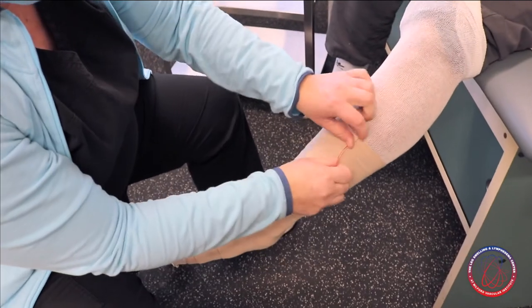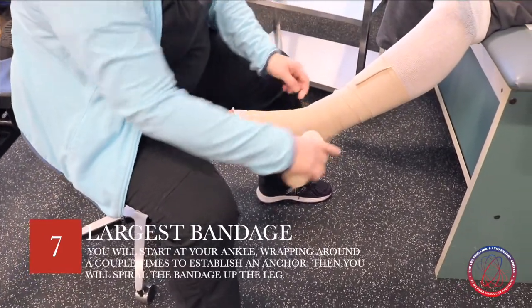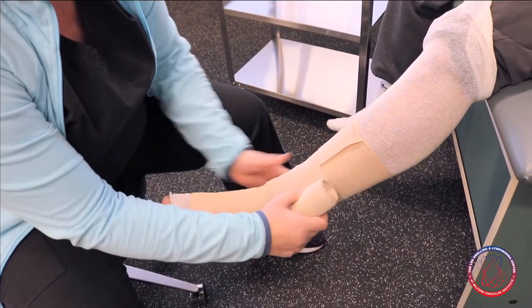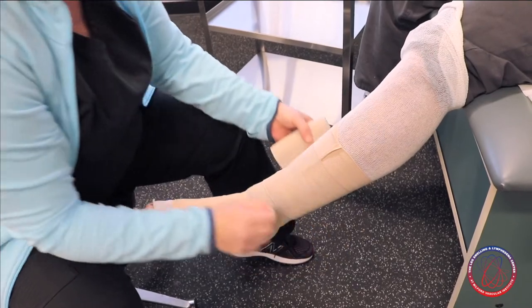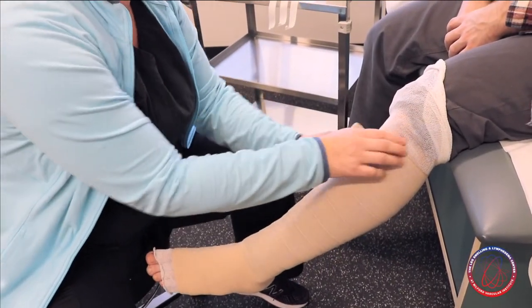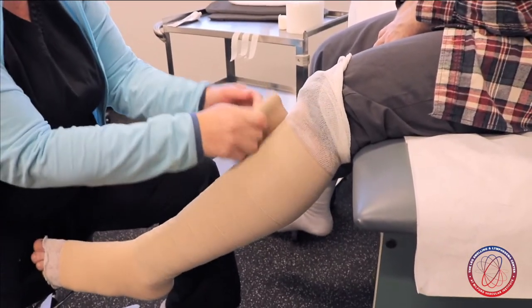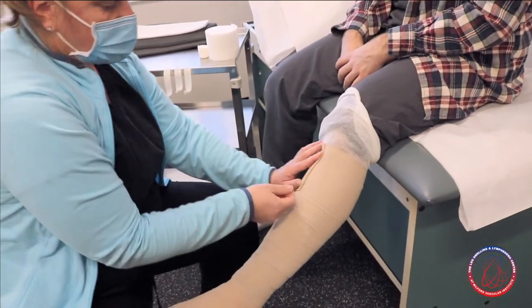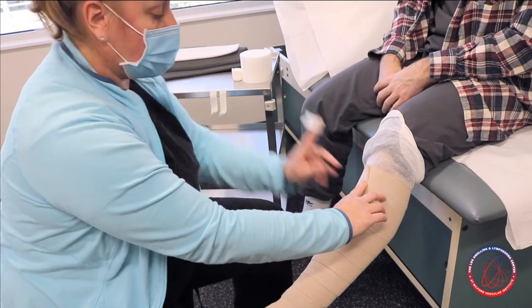Just a little tuck to anchor, and now we have our last bandage. This one starts at the ankle, around where those ankle bones are, and we begin again with our anchor. Then instead of doing the herringbone pattern, we're just going to spiral — bringing it right up the leg going around and around. We bring it to just below the knee, making sure we're not getting too tight behind the back of the knee so that when you bend it's not uncomfortable and doesn't create irritation. I use up the end of that wrap without putting much pull on it since there's a little extra.